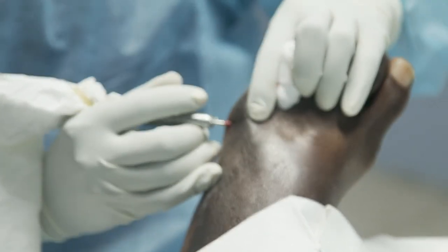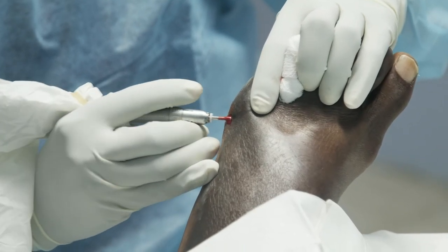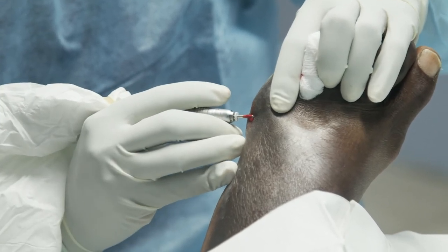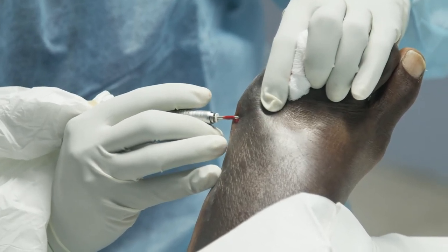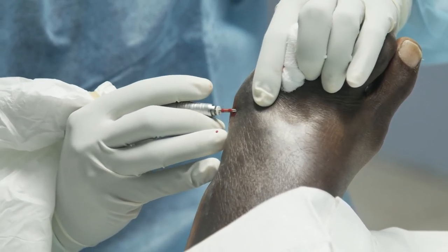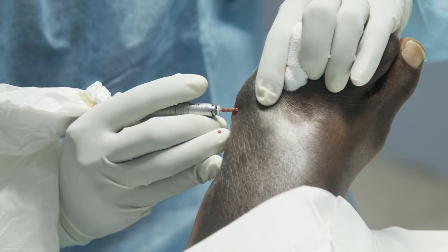Back in the joint. Okay, in the portal. Once you hear that sound, yeah, that's when it's cutting bone. Beautiful. Beautiful.